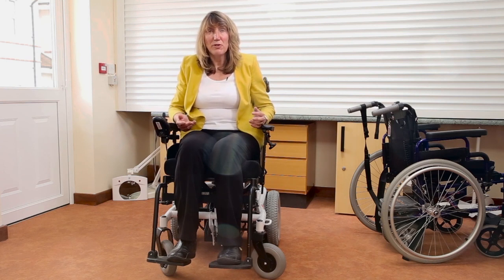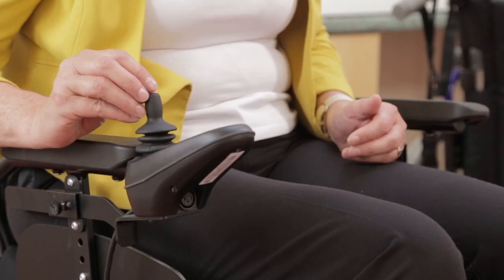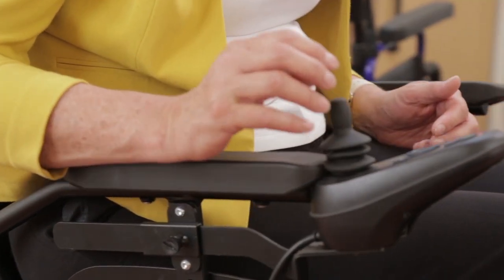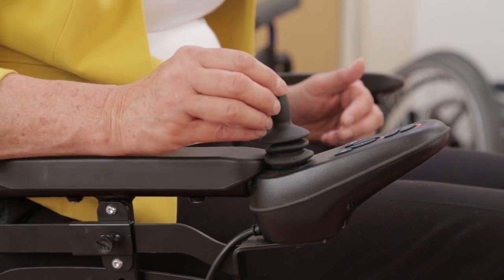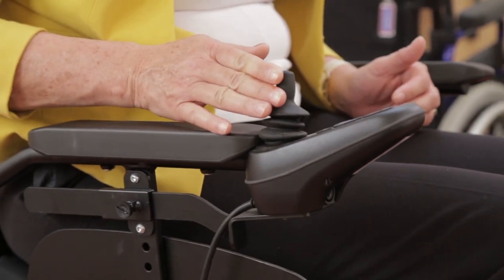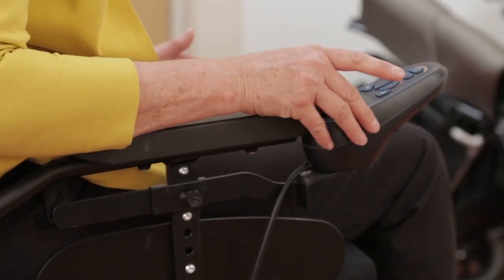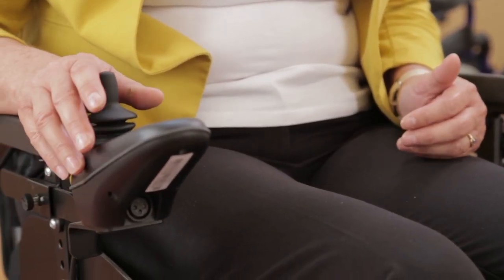And finally, we have an example here of an electric wheelchair, which is controlled by the person who sat in the wheelchair. Normally, electric wheelchairs are controlled by joystick controls, such as this one here. So the joystick is put on the side of the person's preferred hand, dominant hand, and then as you can see, if I take the joystick backwards, I go backwards. If I take it to one side, I turn to that side, and similarly, if I take it that way, I turn to the other side.